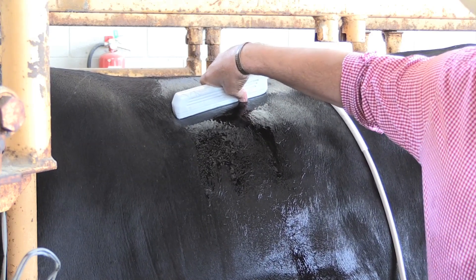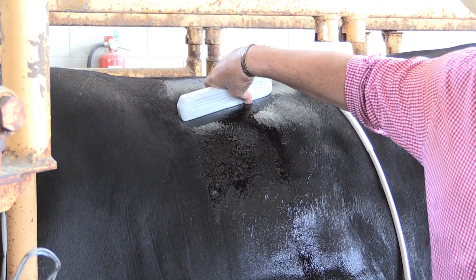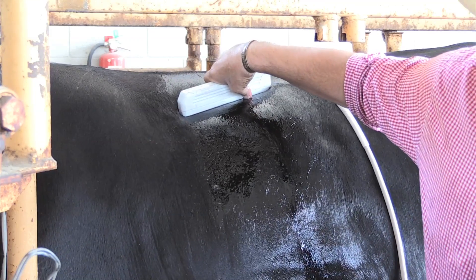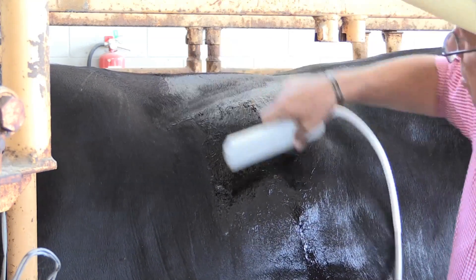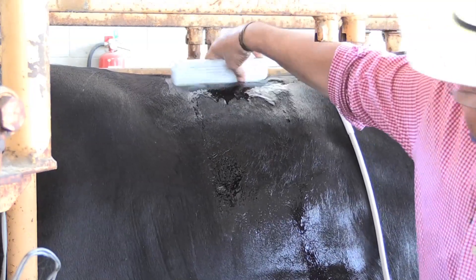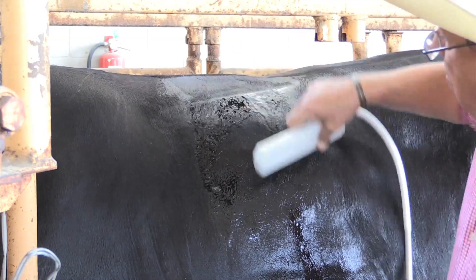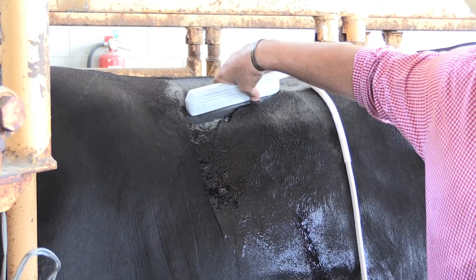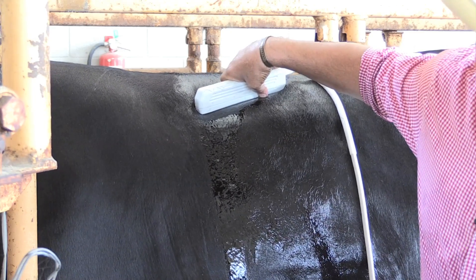We're looking for the same thing — we're looking for the last three ribs in that screen. We want that because we have to measure between the 12th and 13th rib. If I go too far forward, we start getting too much spinalis. If I move too far back, then we get into our lumbars. So we want to be right between or right over the last three ribs. We want to see nice clean rib images show up on that screen.